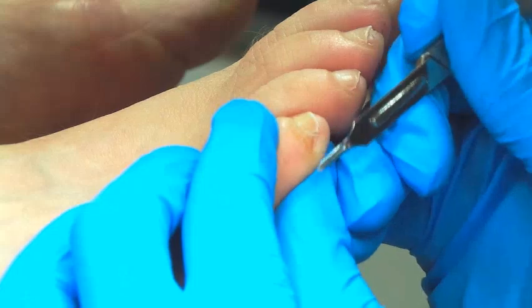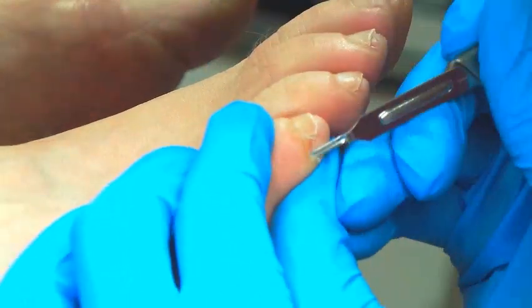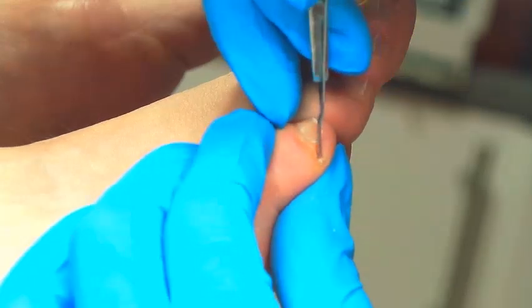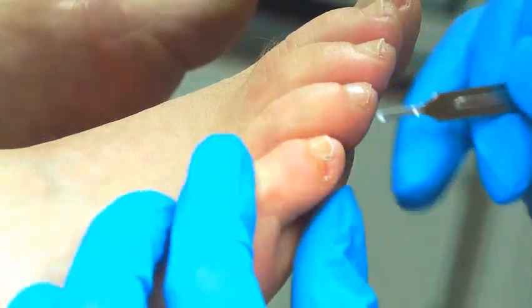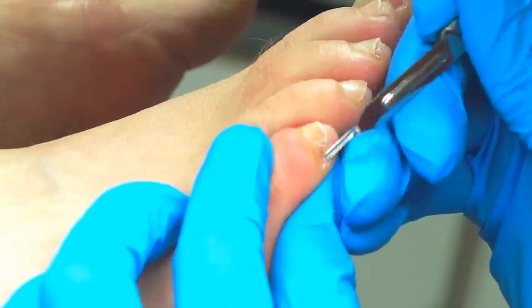You want to just make sure that you do get all the hard skin around the edges off as well, otherwise that can be quite painful. What I'm doing is using this blade as a spoon — going in at an angle and then almost swiveling around, because the sharp bit is only at the tip. So you can't cut anyone like that; the sharp bit is only at the end.